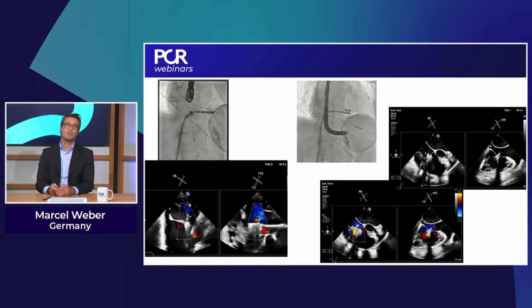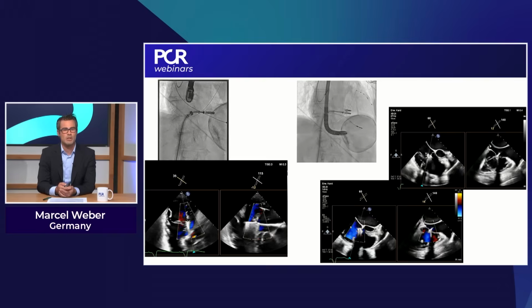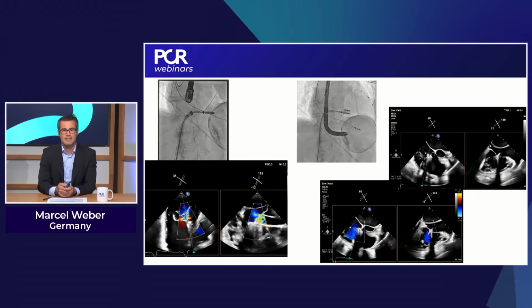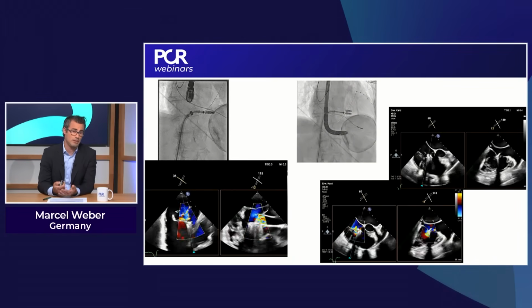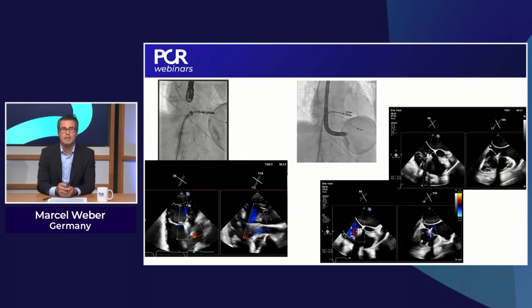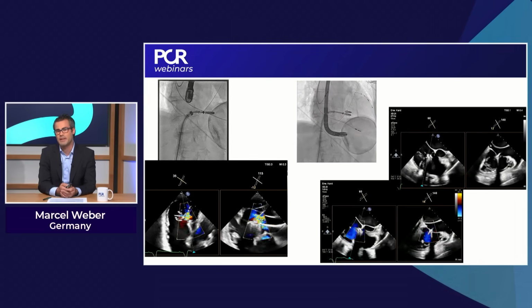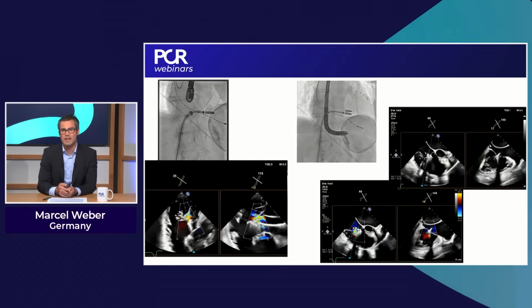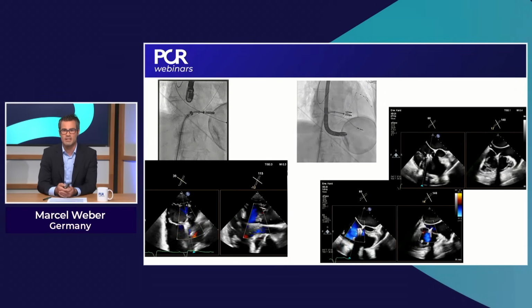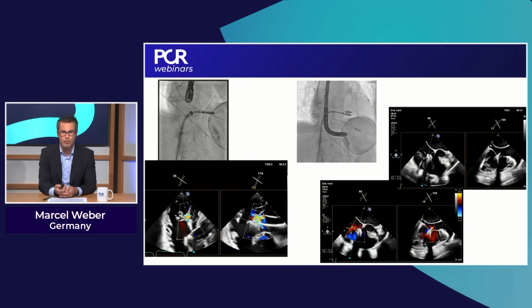Then we headed over to the second clip device, because you see that the TR was not gone. And you see that the second was placed just a little bit posterior of the first one. It is an XTW clip. So, we were very happy. And you see in the upper fluoroscopy that the RV lead is 2 centimeters away and has no interaction with our system. So, quite a better result, but not yet perfect.